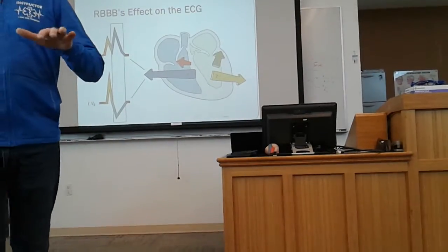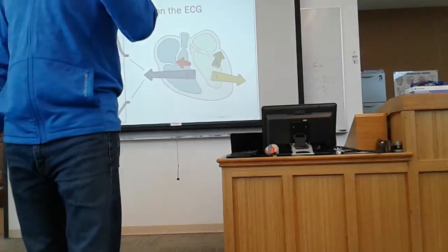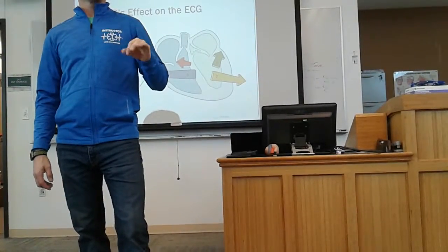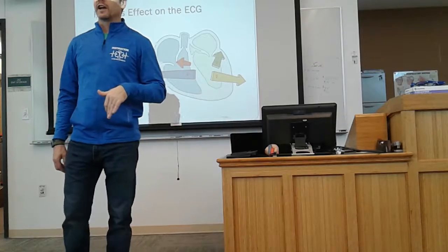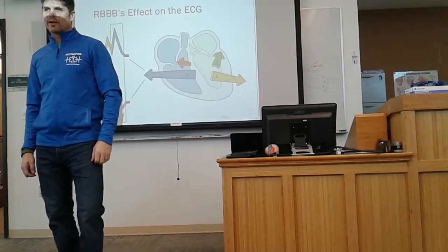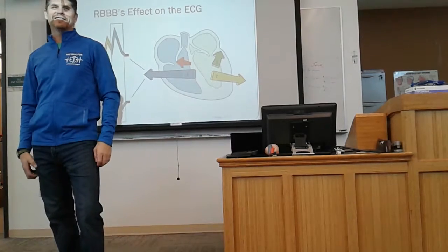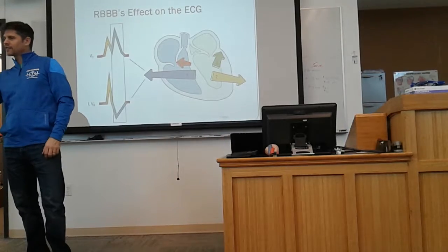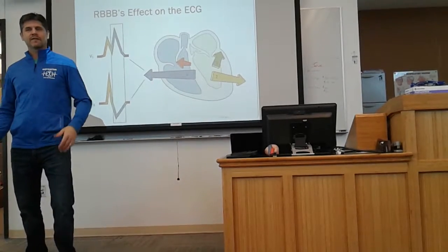Here's a trap that a lot of paramedics get into. I don't ever want you to get into this trap. Break the habit now. A lot of paramedics, when talking about bundle branch blocks, like to discuss rabbit ears. They like to talk about rabbit ears because it's fun to say. Hey, look, they've got rabbit ears. Do you see some rabbit ears here?